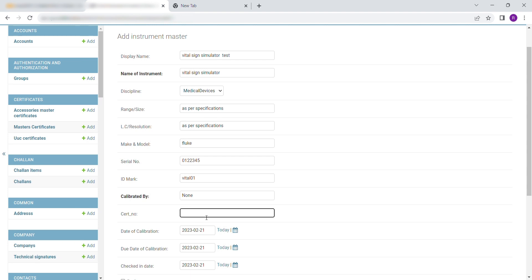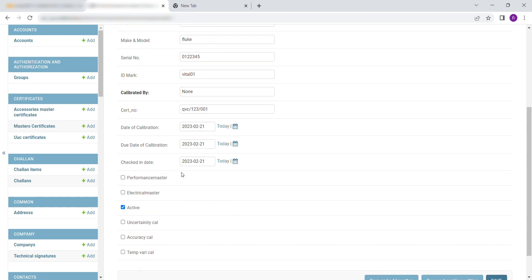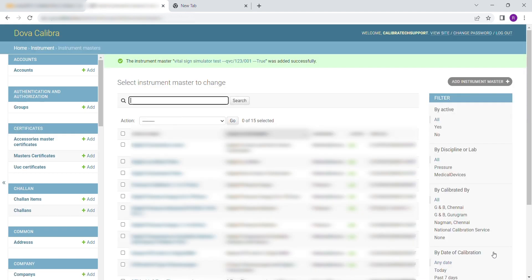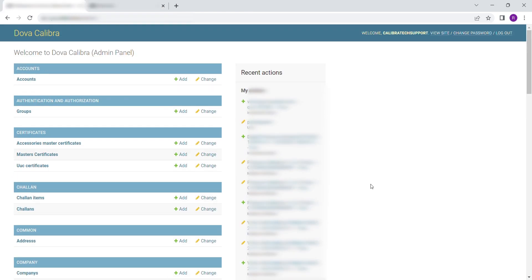Enter the name of the party who calibrated the Instrument. Enter the Date Details. Click on Save to save and exit, or Save and Add Another to continue entering instruments.